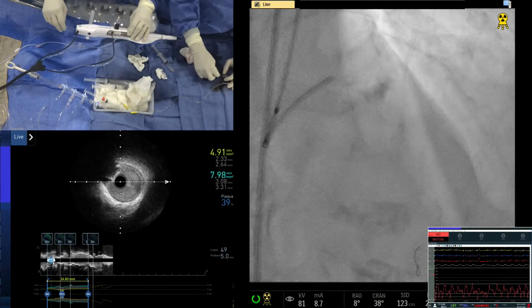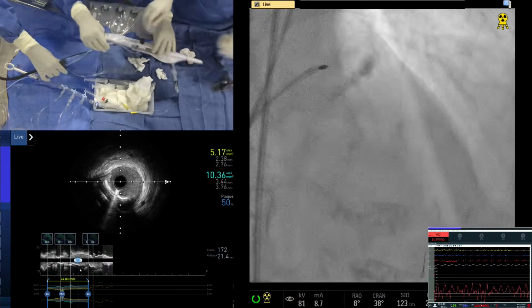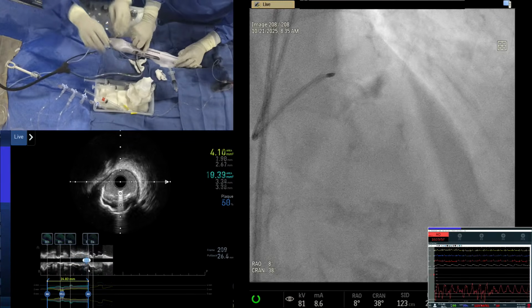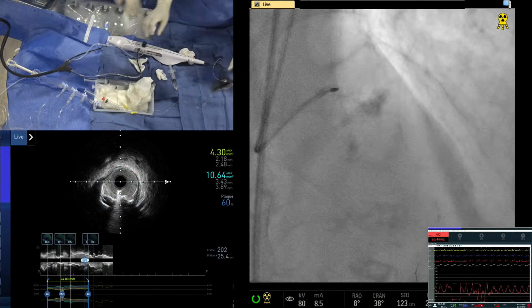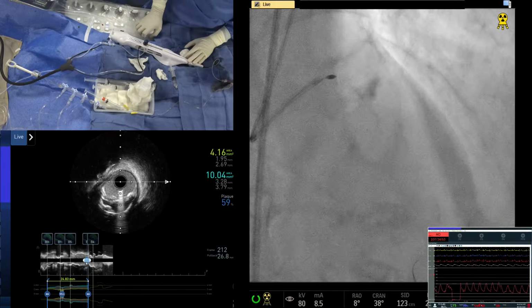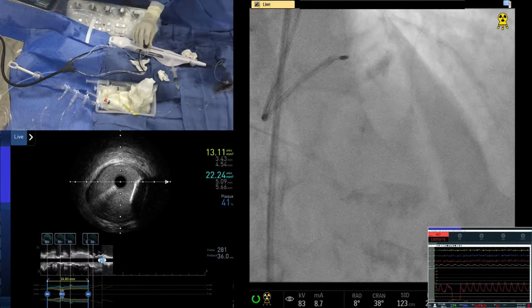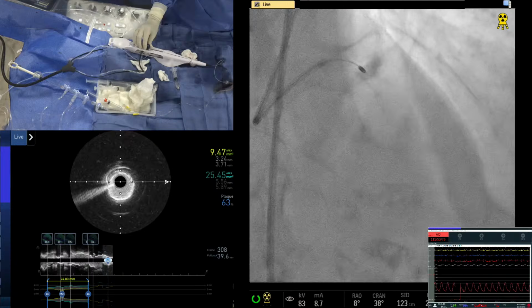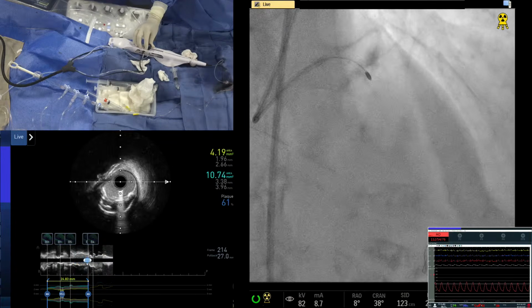Secondly, the question was, if you have diffuse disease of the left main, how do you do it? Remember, many of the parameters are absolute. You have an MSA, MLA there, or whatever the lumen is. So it is all dependent on your vessel itself. It doesn't have to be comparative. So if it's less than 5.5, that's it. It's severe. Yeah, okay. That's right.